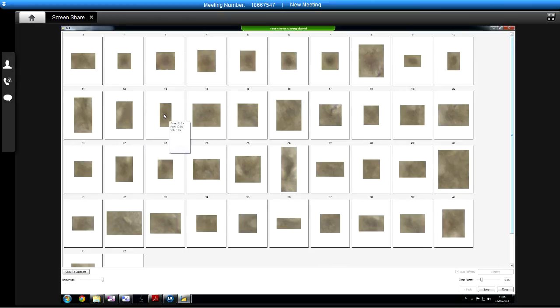Number 16. Oh. That's again is 95. Yeah, 17 probably. 17. Yeah, 17. What that one there? 17 on below it. 27. Oh, is it? Oh, sorry. No, you're right, 17. That's a false, isn't it? Yeah. And then what was it, number 26? 20, yeah. Wouldn't count that.